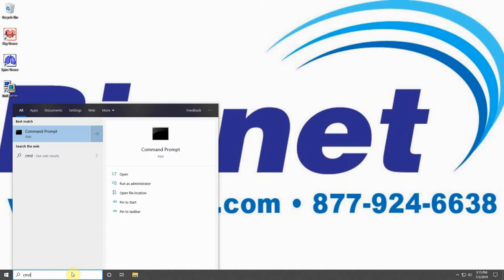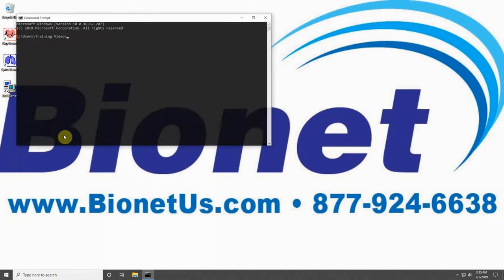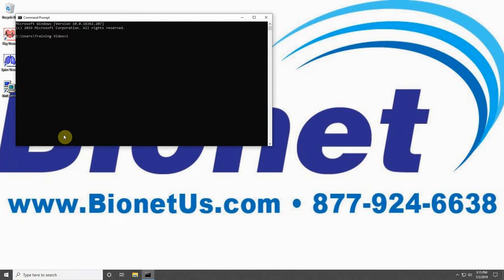Start by typing CMD into the search bar or Cortana. Click on the Command Prompt link that appears, type IPCONFIG as you see it on the screen, and press Enter. The IPv4 number is your computer's IP address. Write this number down, as you will need it later.